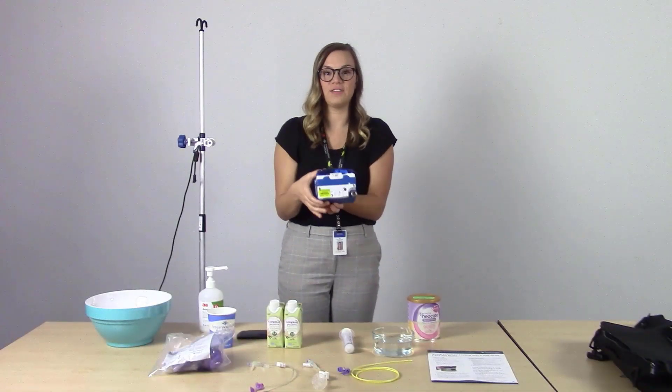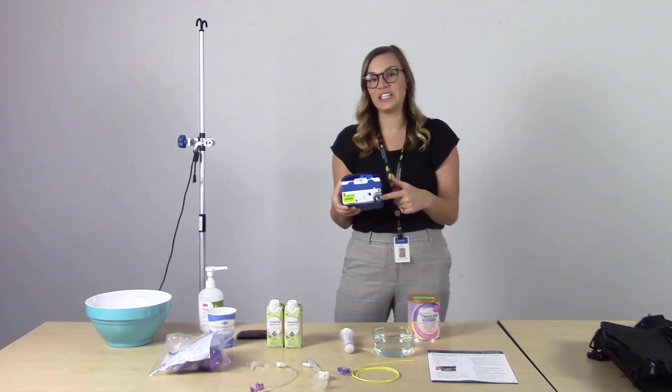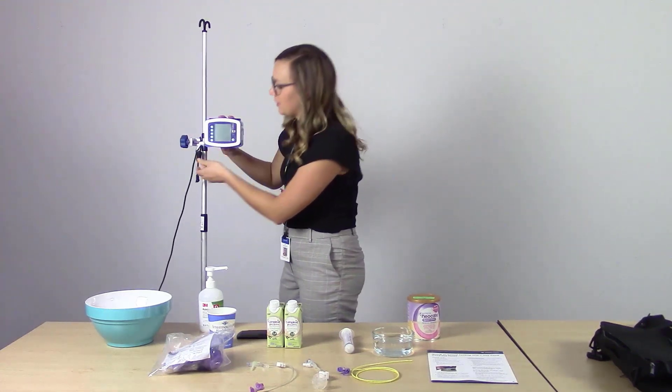As you can see, on the back of the Joey Pump there's a metal notch that can connect exactly to the pole clamp. We'll make the connection and secure it in place.